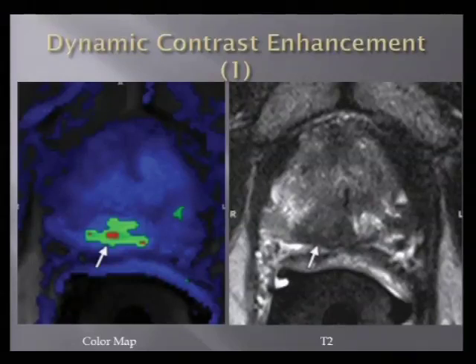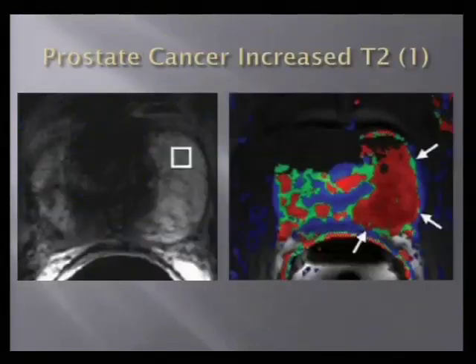So in general, you have three different landmarks to look for when you're trying to evaluate: is something cancer, is it not, or where is the cancer going? If it fits all three, it's likely to be prostate cancer because there are very few things that'll do that. Of course, there are some quandaries, it's not quite that simple, but that's why they call it multiparametric, using all three of these.